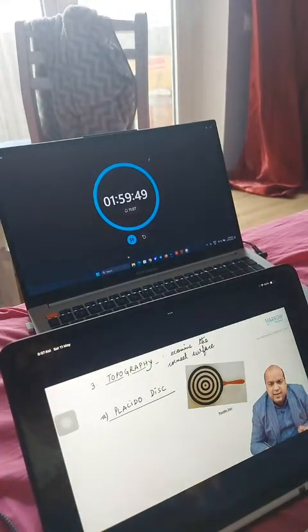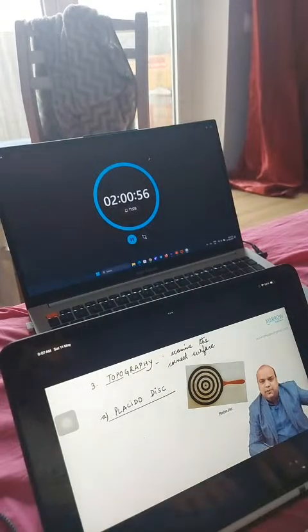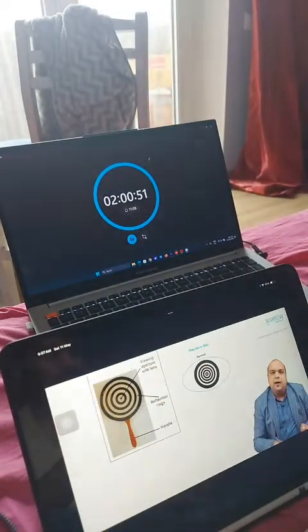and light colored alternating rings, as you can see in the image. A light is thrown on this placido disc. This light reflects these rings onto the patient's cornea, and we are able to visualize these rings. Let's see how, everybody. So this is how a placido disc works.